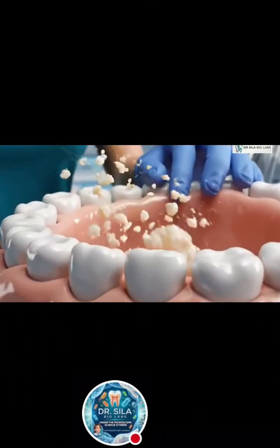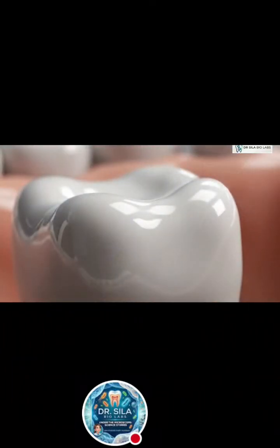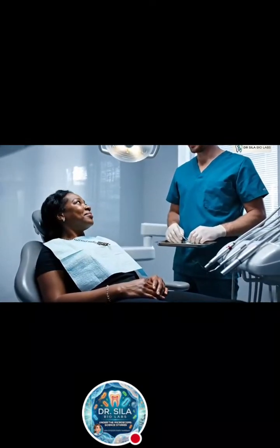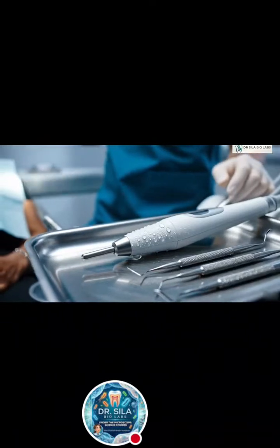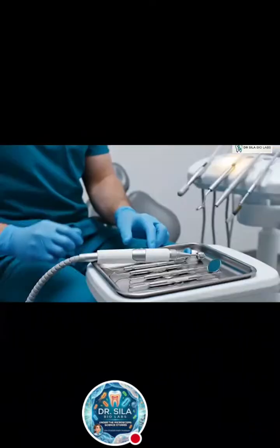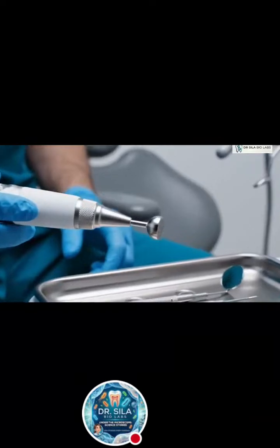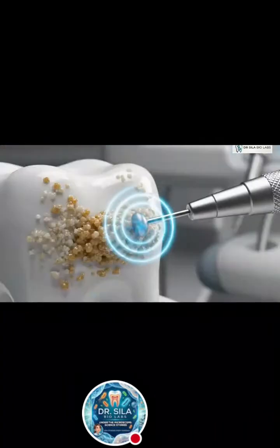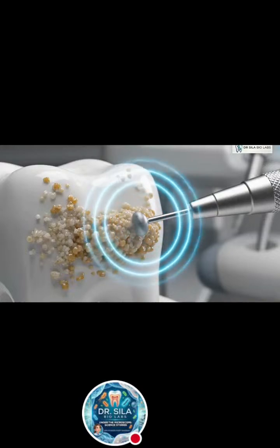In the next section, we'll explore how dentists remove calculus hidden deep beneath the gum line. One of the most effective tools used during scaling is the ultrasonic scaler. At first glance, it may look like a simple metal instrument, but its tip vibrates thousands of times every second. These high-frequency vibrations are powerful enough to disrupt hardened calculus. Rather than scraping aggressively, the instrument uses vibration to fracture the deposit.